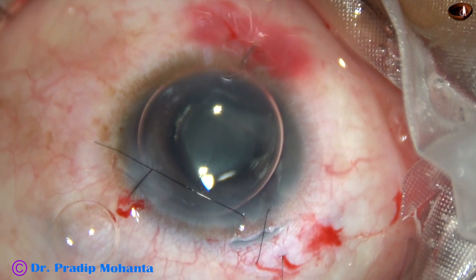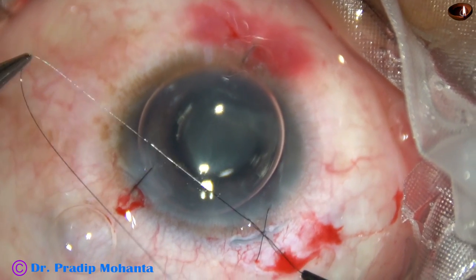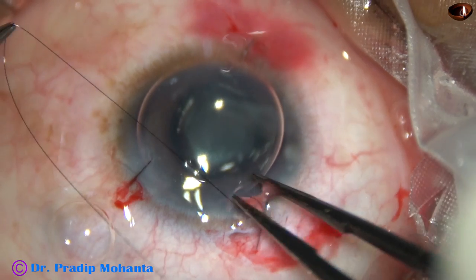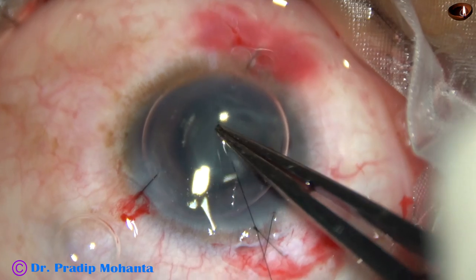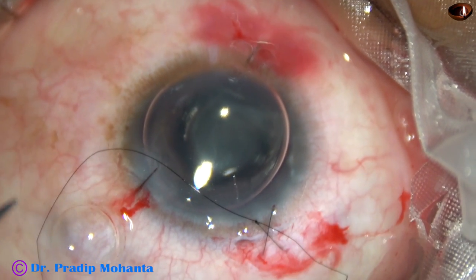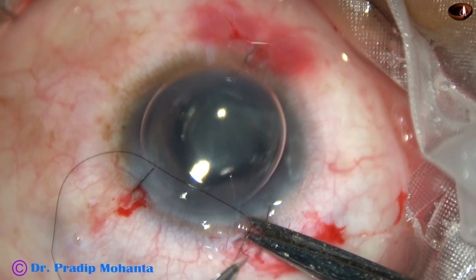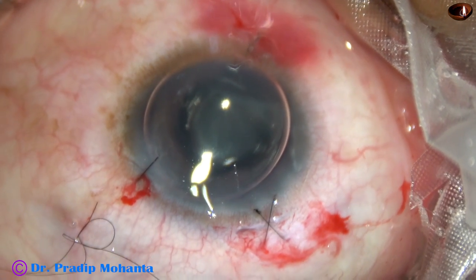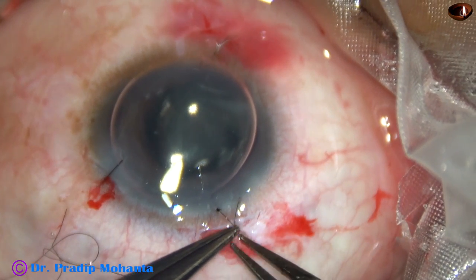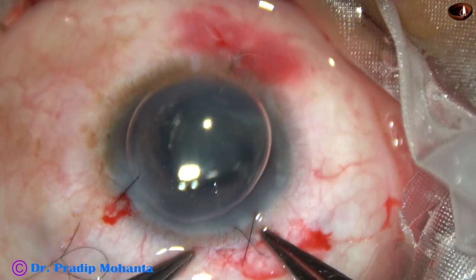Now the main wound is being closed with an X suture, because this wound is larger at about 2.8 mm and the patient has low scleral rigidity, so an X suture is used to close this wound nicely. The knot is made with 2 throws and 2 loops. Pull the thread and just oppose the wound. The threads are trimmed near the knot, and now the knot is buried into the tissue by holding both suture ends simultaneously.